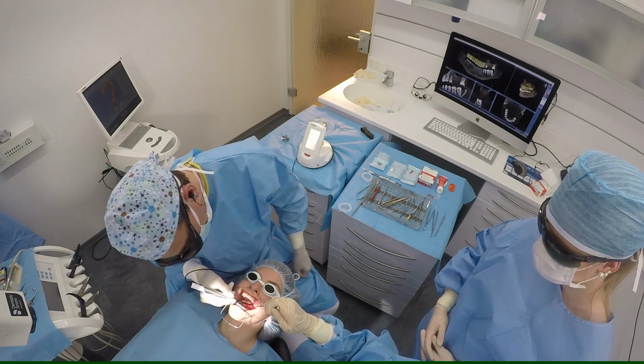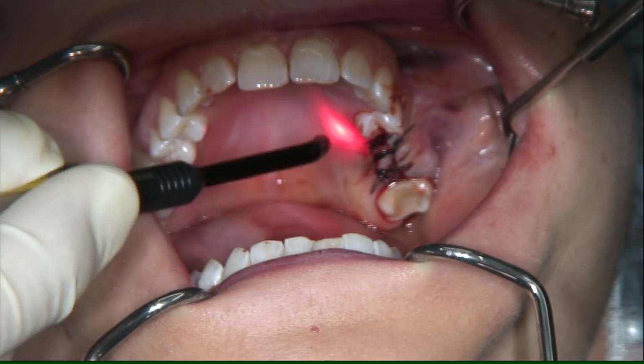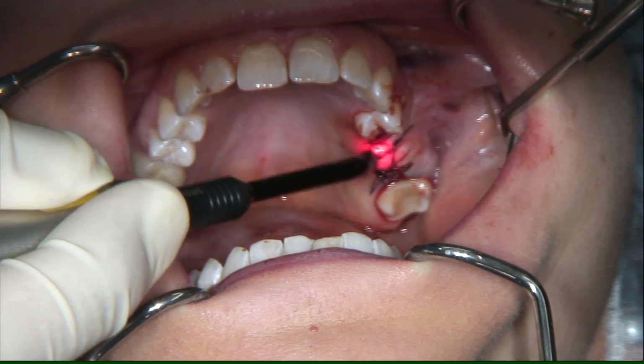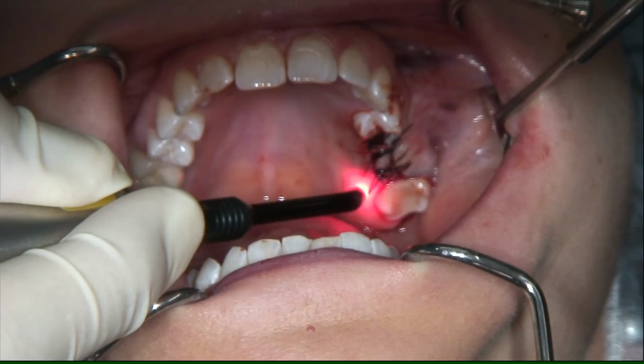So the cutting mode is used for cutting and for hemostasis, when you have lots of bleeding, but you should never be in contact with the bone when you're using the blue diode.